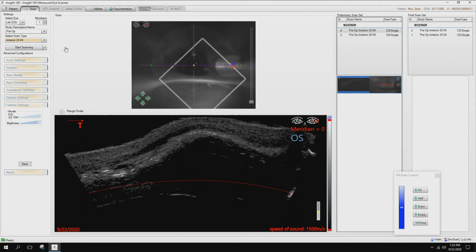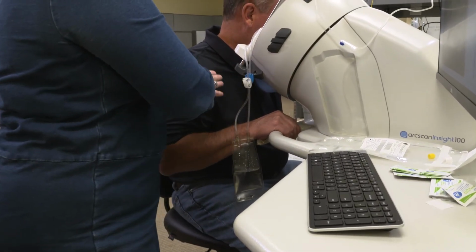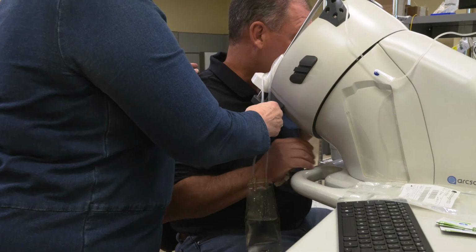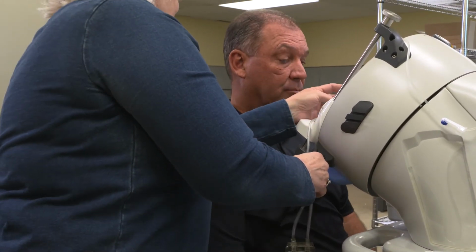I understand that you want to have patients moving through the clinic quickly, and there is a lot of pressure on you to have the patient workflow be uninterrupted. However, it is altogether more important to get a good quality image, and with a little practice, you should be able to get an easy image first every time.